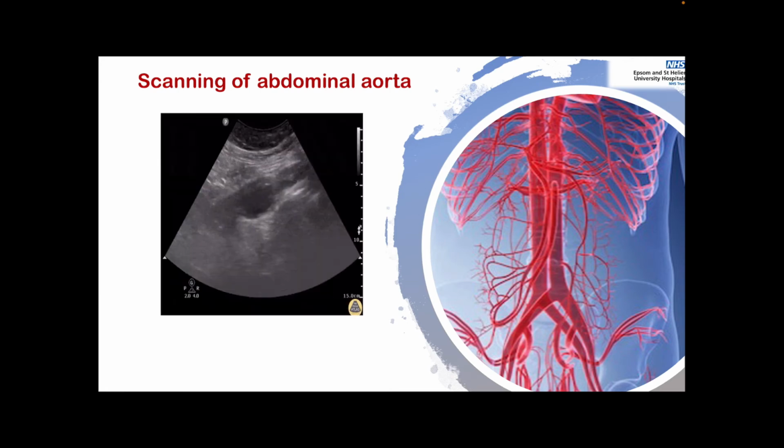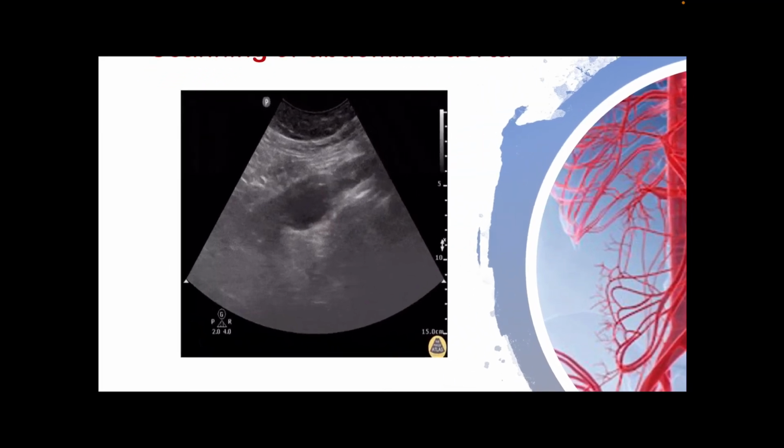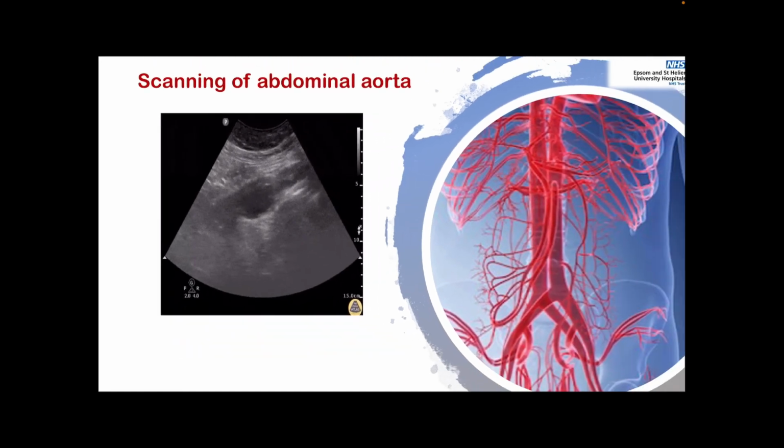Right. There is another, this is a longitudinal view. And you can see here, if I want to make the dimension, I will go from up, down. So you can see this is up and down. Okay. And here we can see there is a flap of dissection. Can you see this flap?